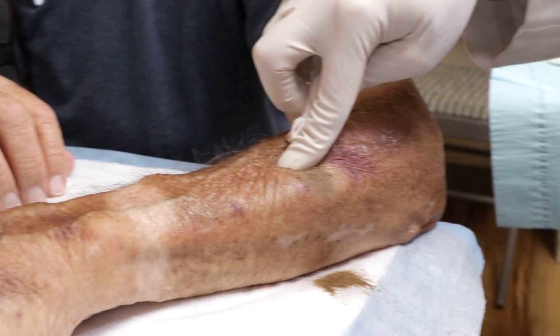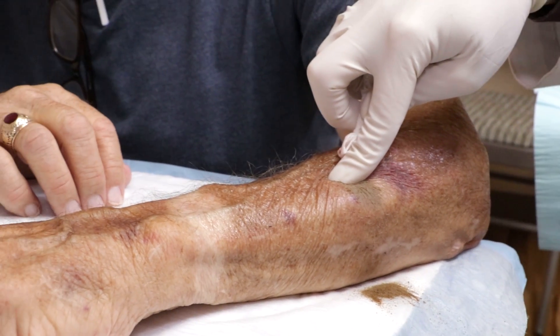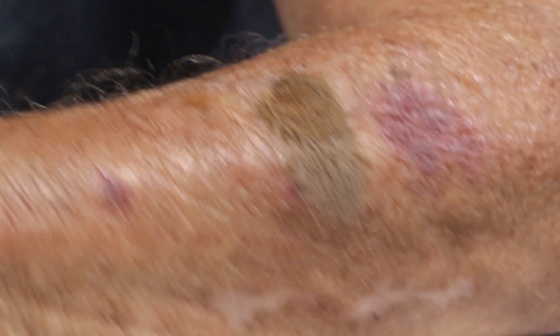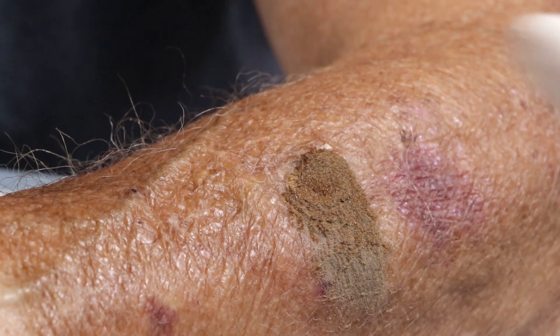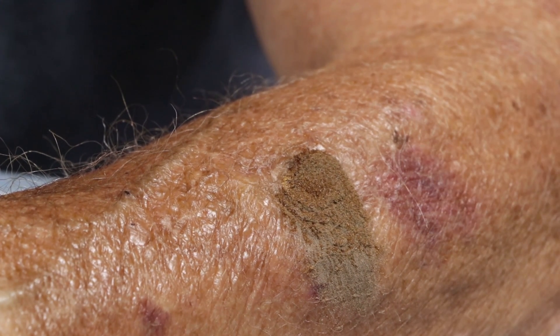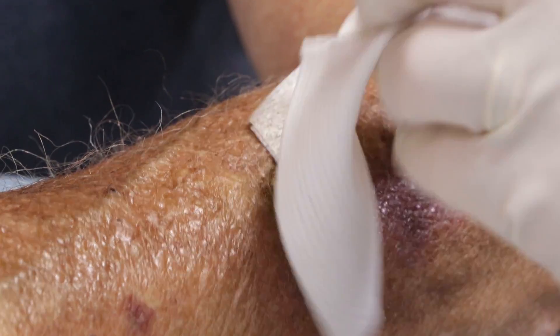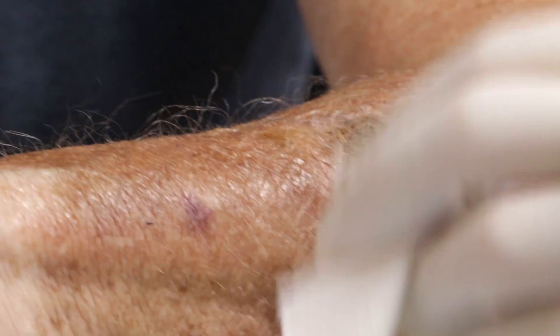We're going to hold that down there for about a minute. We're going to take the finger off and find that it's already scabbed over. You don't even have to do any kind of dressing on it. Look at it - it's already got a scab on it. Isn't that nice?